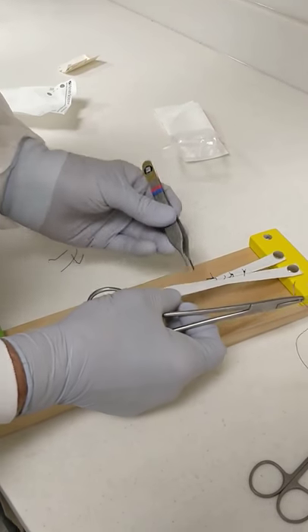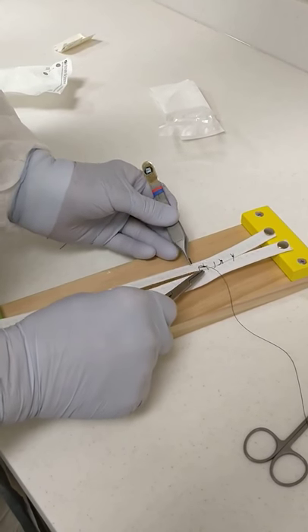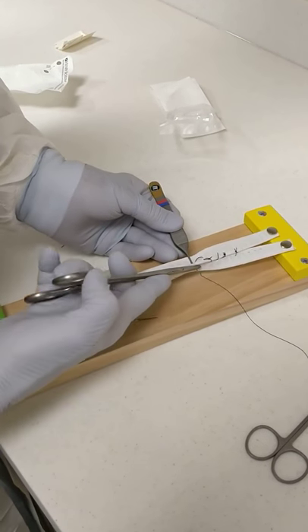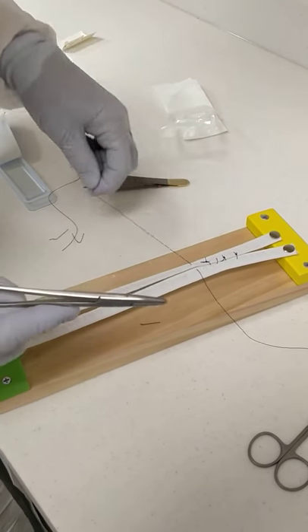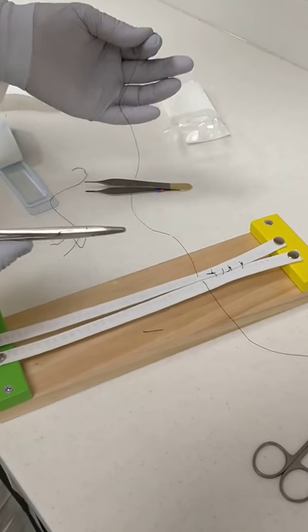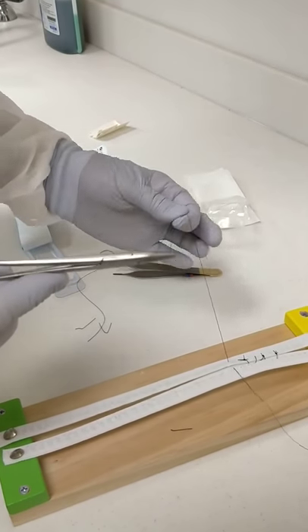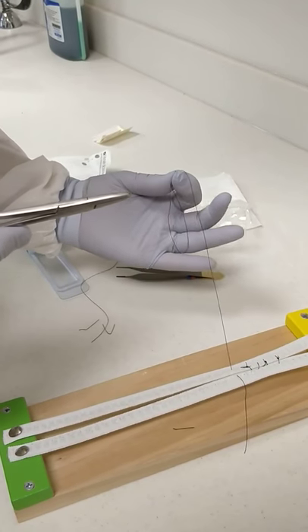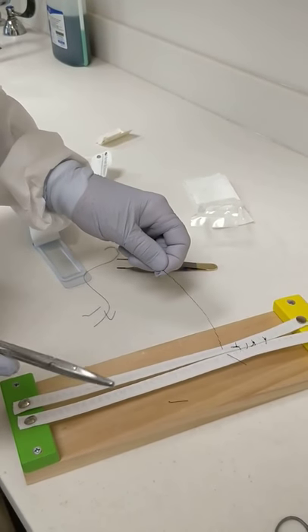This is done. Make a simple suture, you can watch me palm this. Grab it there. Let loose. Pull it through. Now, I've got control of my suture.